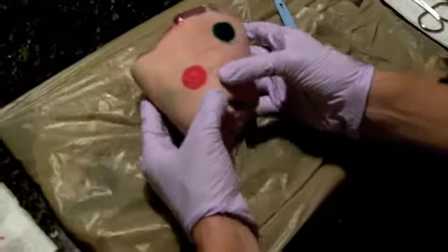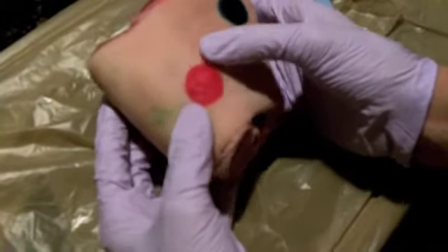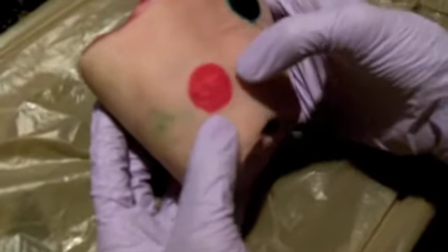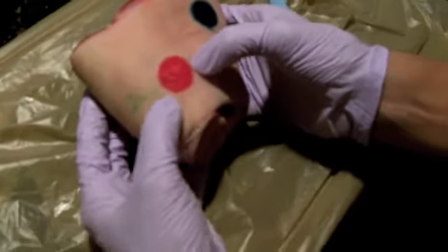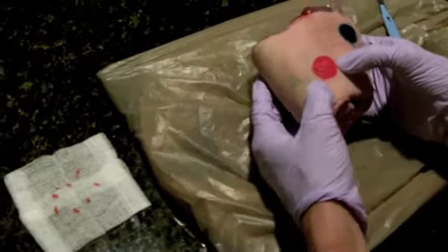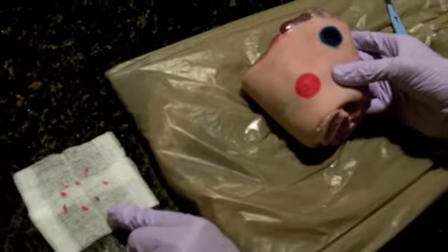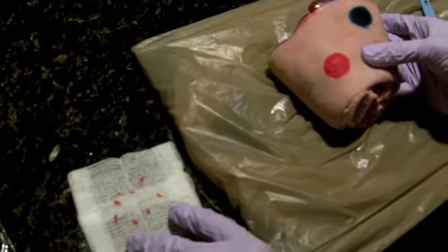Okay, so it's been debriding — shaving. It still has the dye; we're not down to viable tissue yet. So it's just a lighter shade of pink, basically. And there are my shavings.